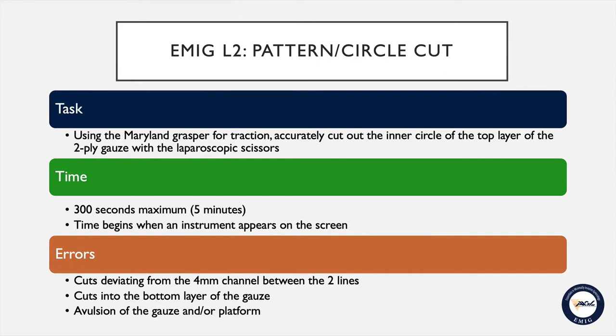To perform this task, you will use the Maryland grasper for traction and you will accurately cut out the inner circle of the top layer of the two-ply gauze with the laparoscopic scissors. The maximum time limit for this task is five minutes or 300 seconds.